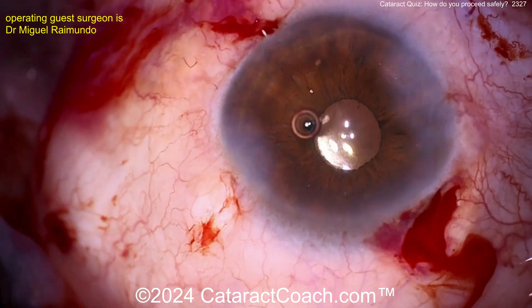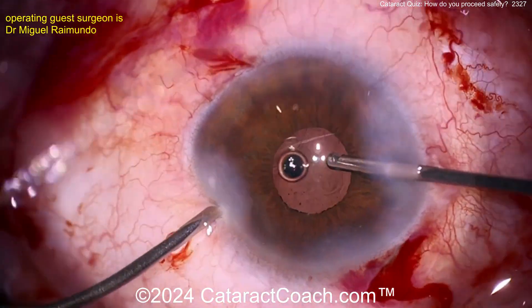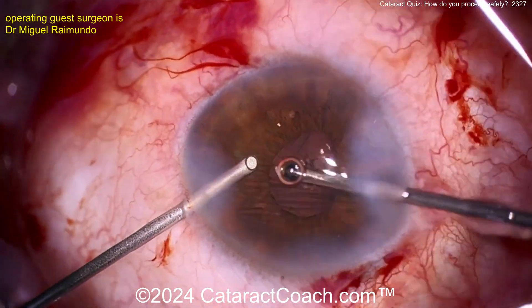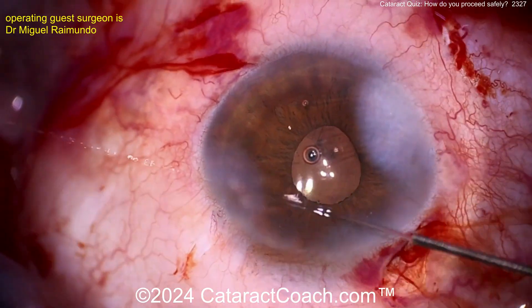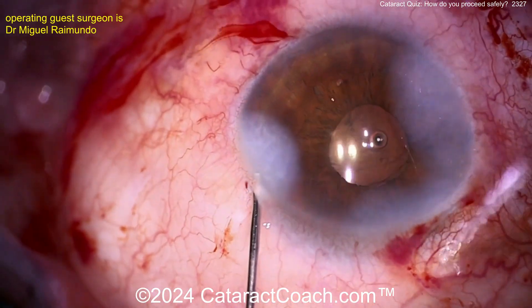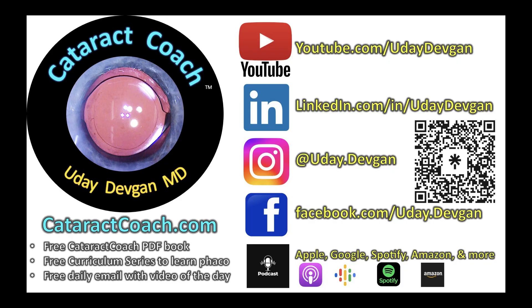If you're at the nine-minute mark, very few watch this far — you deserve a special prize. Final checks: making sure there's no vitreous in the anterior chamber — there isn't, the pupil is not peaked at all, looks great. I'd put some triamcinolone on the eye to confirm no vitreous and for inflammation control — it'll quiet down the eye in the post-op period. If that incision has even a tiny leak, put a suture in. Beautiful case, fantastic job recovering from a tough situation. Podcast every single week — it will make you a better ophthalmologist.